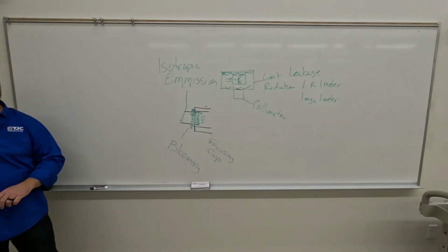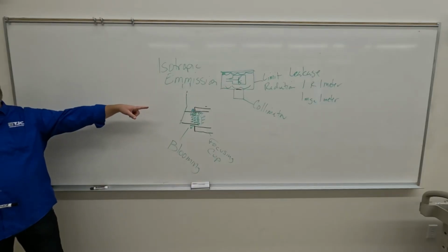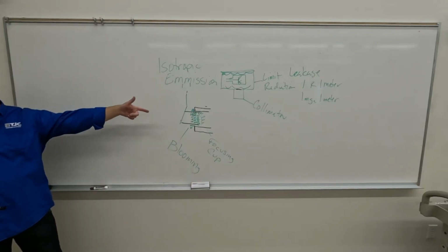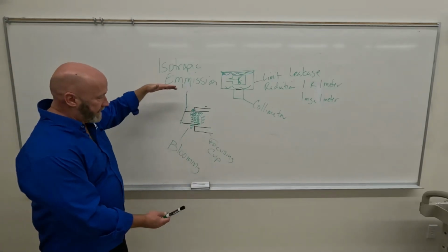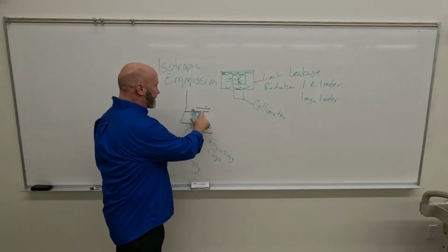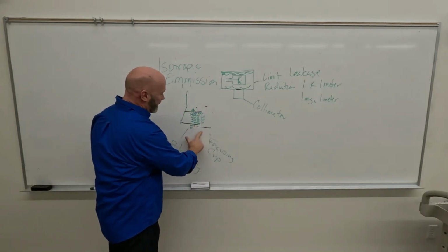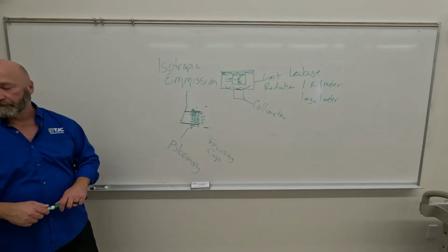I think you're saying it. No voltage, like you didn't have voltage on the focusing cup. Focusing cup failure. Okay. So when there's no voltage, it's not compressing the electrons anymore, and so we're back to almost as bad as not having a focusing cup at all. The electrons going everywhere.